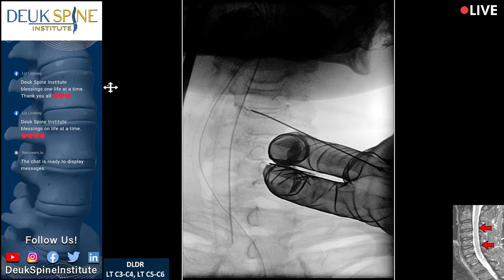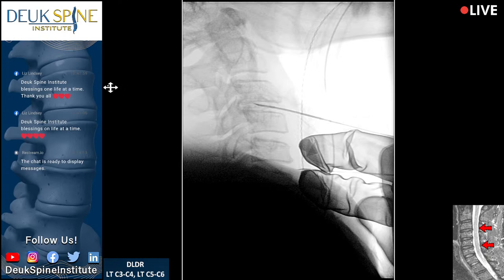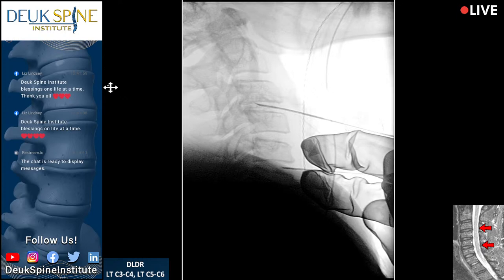Let's go back and get a lateral. I'm going through the disc now in the midline — this is the 5-6. What you're watching, folks, for those who don't know, is the most state-of-the-art spine surgery in the world. It's endoscopic, so it's very minimally invasive.